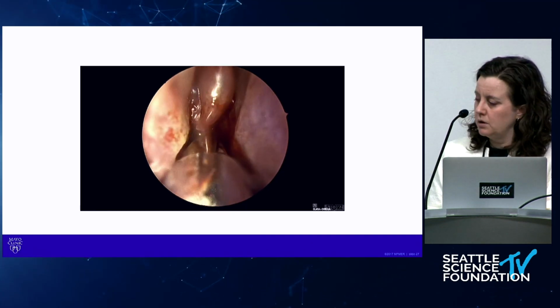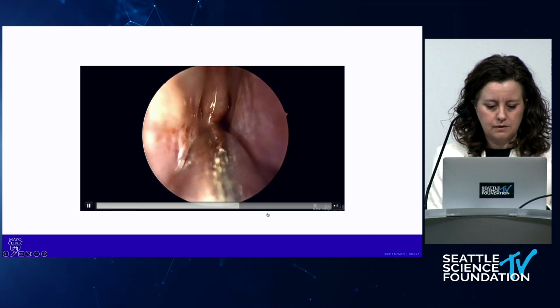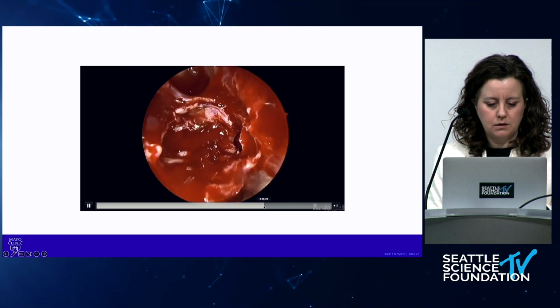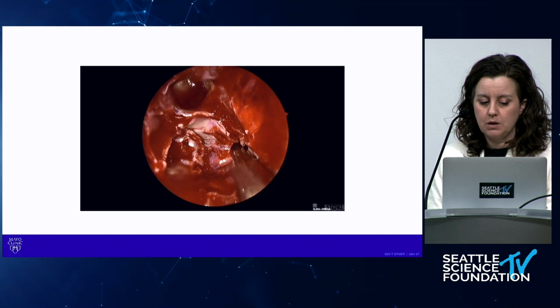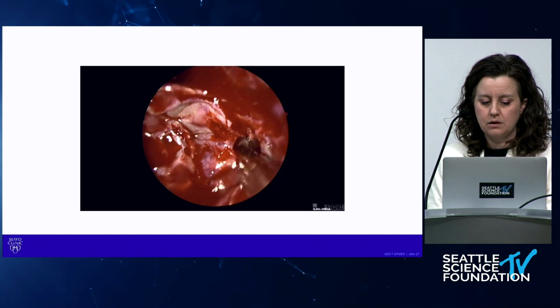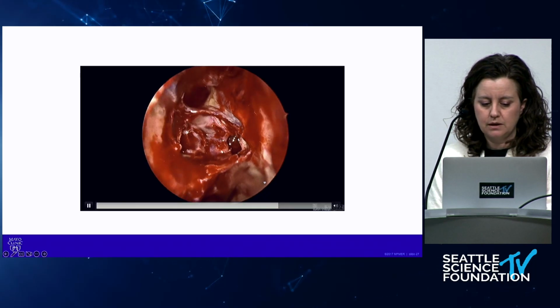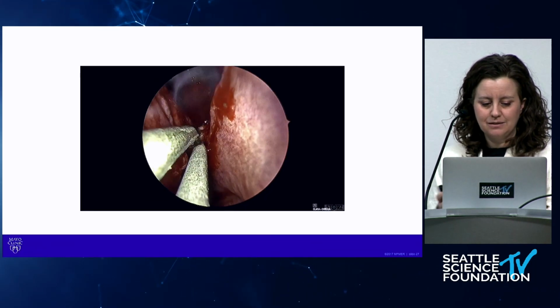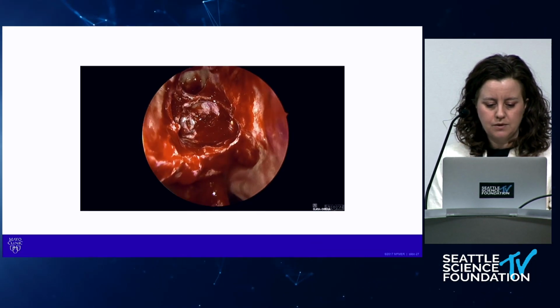Dissecting a little bit more, we're opening up these posterior ethmoid cells from the medial aspect. Let me go back a second. If we now are trans-ethmoid on this same patient, now we're going lateral. Here's the sphenoid that I had found. There's still a little bit of posterior ethmoid cells. I can open those up and clean that up. I'm back to transnasal now and can open up that sphenoid.